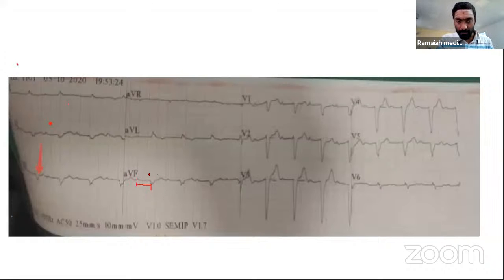Then the QT interval we look at. The QT interval looks overall okay, less than half. So QT is normal, I think. After this, we look at rate, rhythm, intervals. What about the axis now?